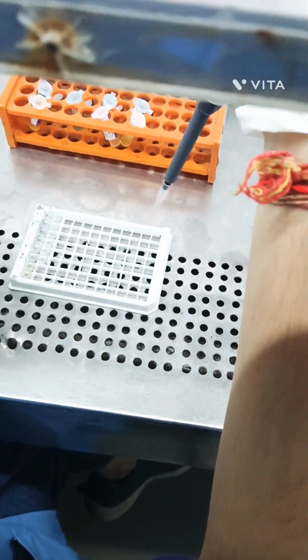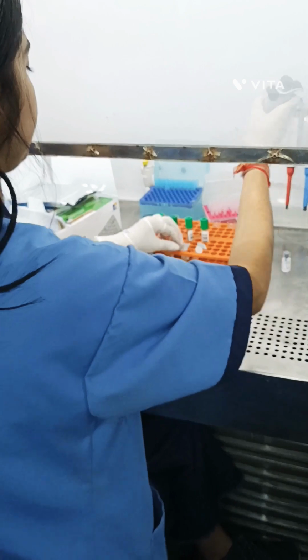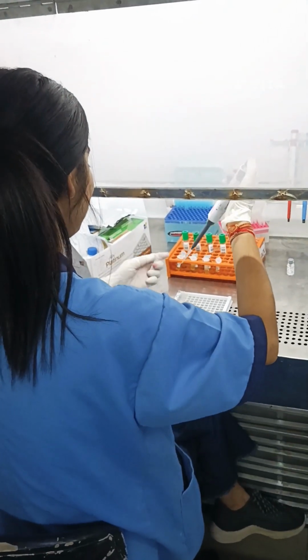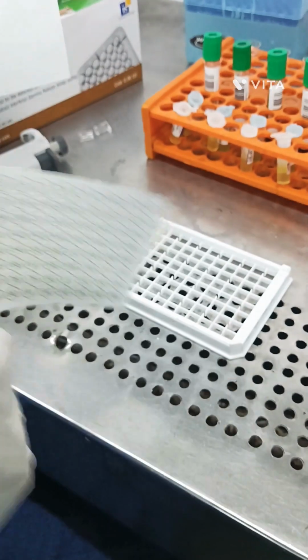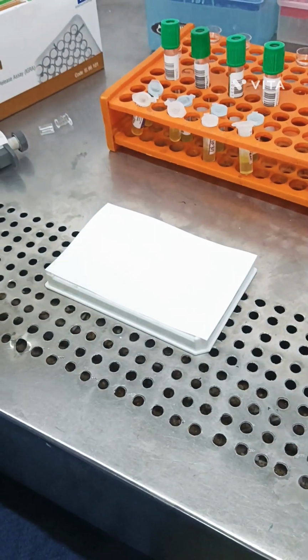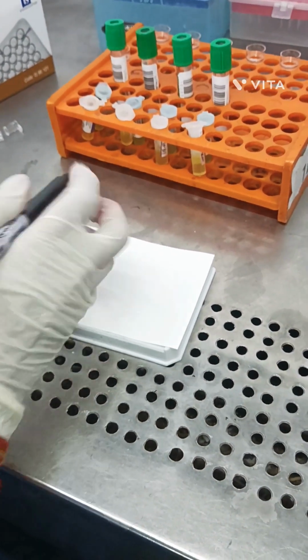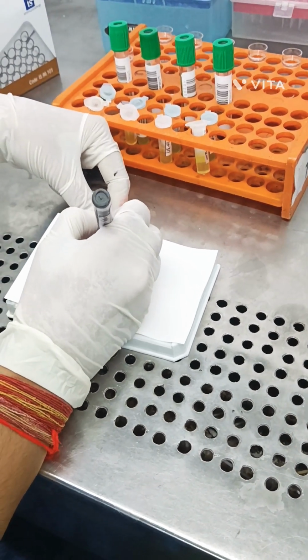So next step, we have to add conjugate. So what is a conjugate? Conjugate is a prepared horseradish peroxidase conjugate, anti-interferon gamma antibody.